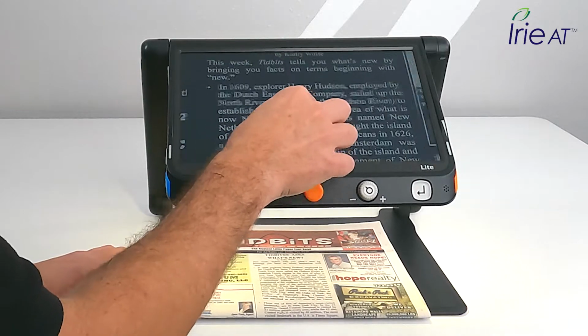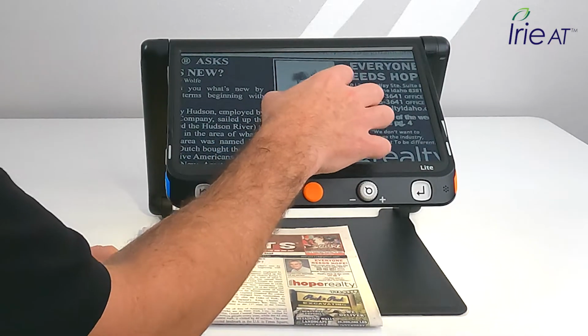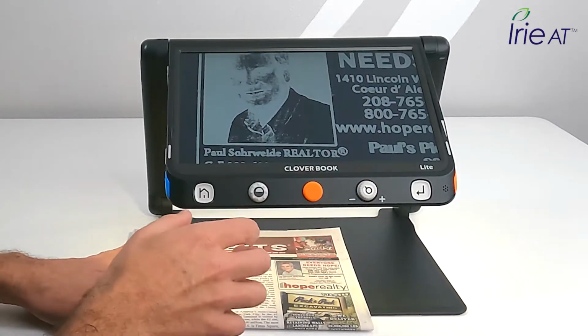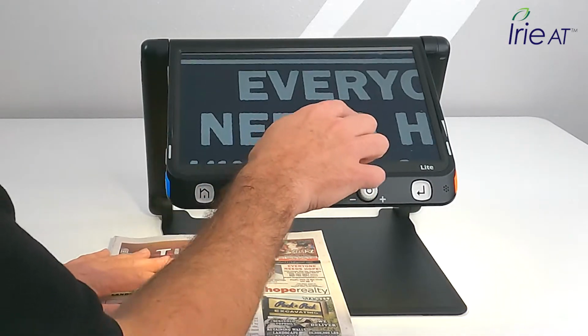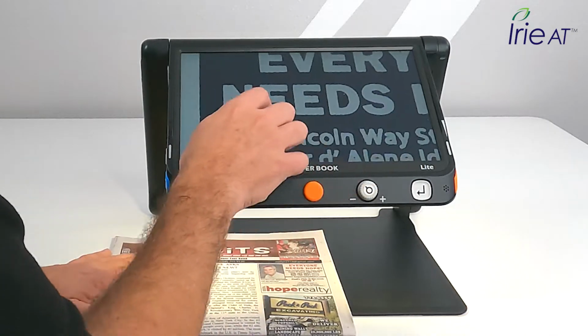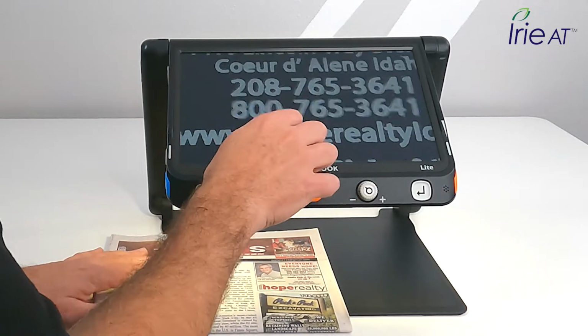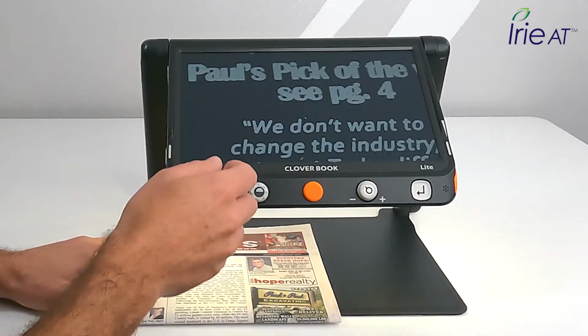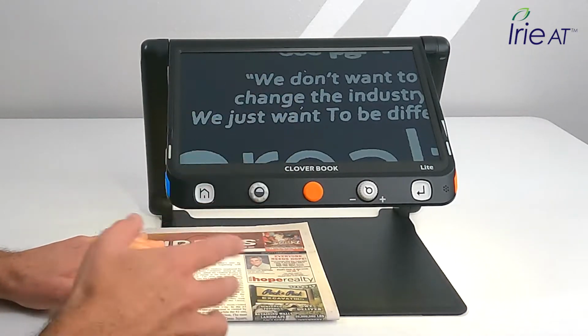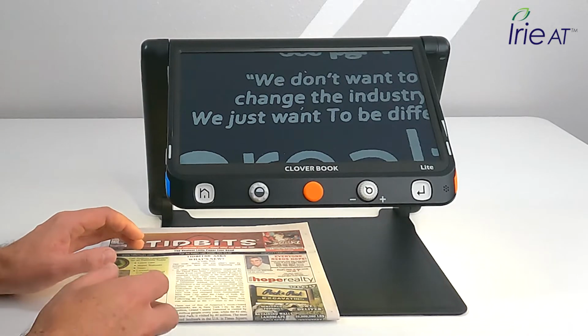Zoom out, okay, I found what I want, okay, I want to zoom in. I do kind of a combination of move the material and move this just to minimize my movements and make it easy. It's simple to read through. The more advanced models take a picture of the whole thing and you can see it all at once and do some stuff. But for me, this is pretty handy to just be able to pan around and move around in the material like this.